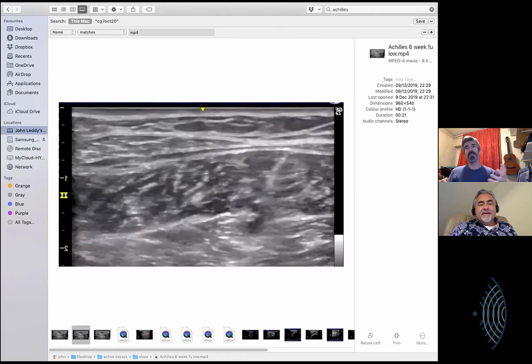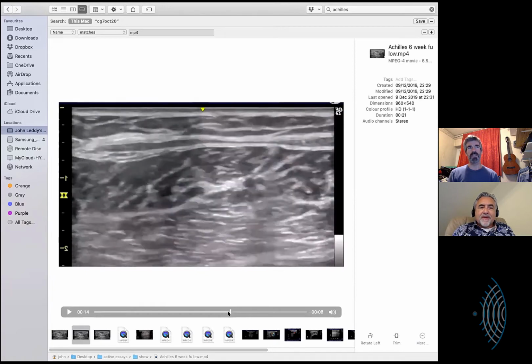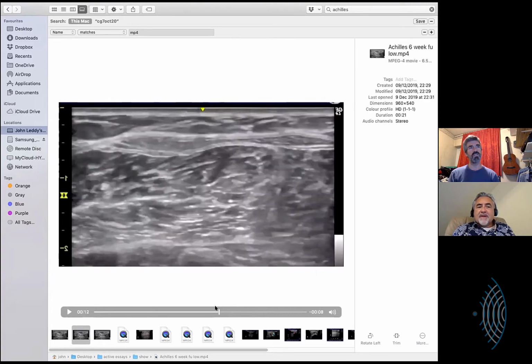They're the bits of aponeurosis, for want of a better word, fascia, that actually make up the infrastructure of the muscle, and you follow these, and that was a big turning point in my scanning. It was when I stopped looking at it as noise inside and started actually following these. I still do. I will sit when I'm scanning a muscle, particularly a difficult muscle to understand, and I will watch where all those dots are going, because they drift across the screen. You can see them drifting across.